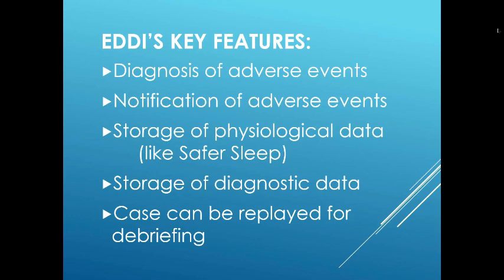The physiological data will be stored and saved to a file, as will the diagnostic data. These stored data can be used to replay the anaesthetic for teaching or for review. There are no patient identifying data in these files.